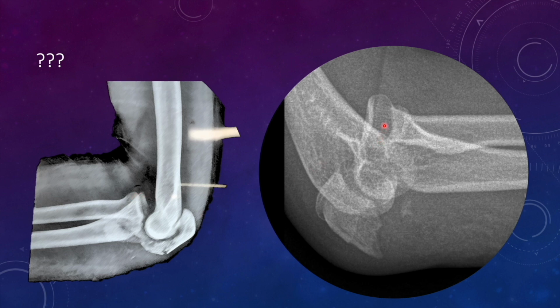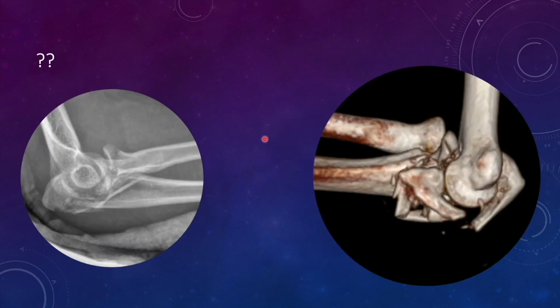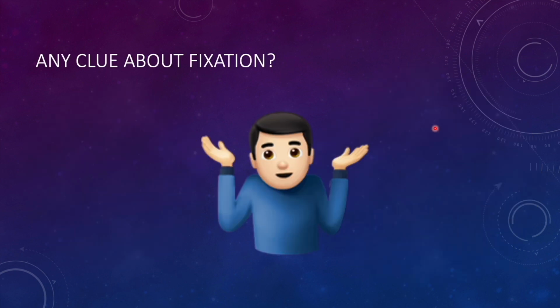In this image also you see there is anterior subluxation of the radial head, there is a separate chunk of the coronoid, you see here, and there is a separate chunk of the olecranon, and the whole of the ulna is subluxated anteriorly. So these were not classified as per Jupiter. In this image also you see there is extensive comminution here, there is a separate chunk of the coronoid. In this image also you see there is a separate chunk of the coronoid, and there is a separate chunk of the olecranon along with the extensive comminution in the metaphyseal region, and the radial head is subluxated anteriorly.